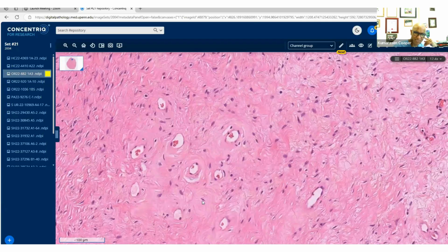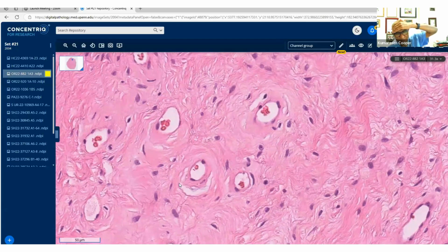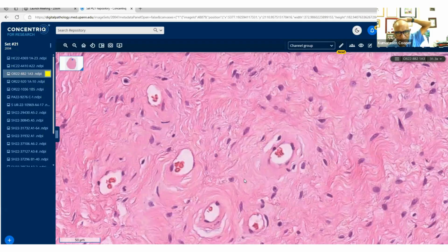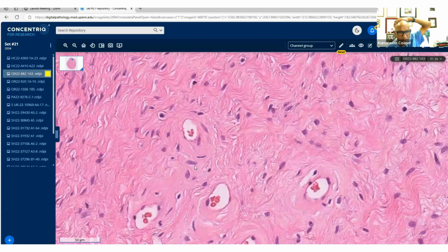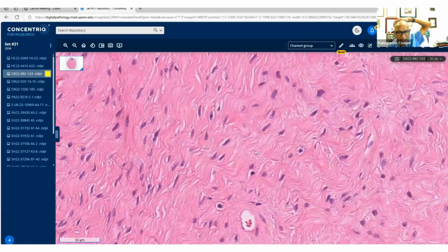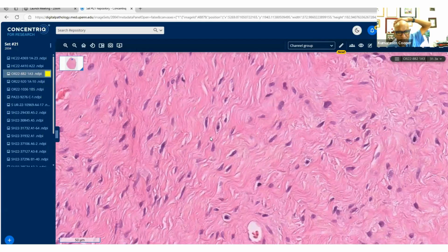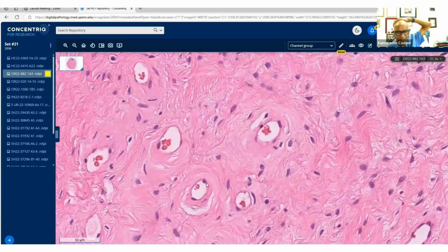I'm going to show you these vessels. The capillary-like size of, okay, and the spindle cells look very bland. And here you can even see some mast cells. Again, not trying to deceive you. Maybe a mast cell, I'm not sure. But here you can see spindle cells, not with any particular pattern, but you can see this wavy sclerosis. And here's these nice capillary size vessels.